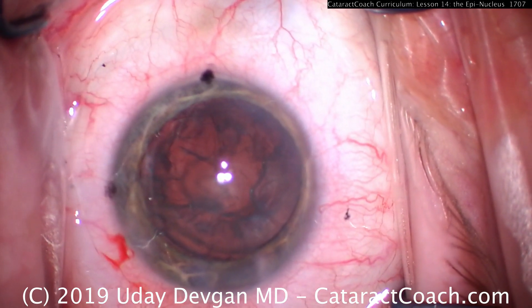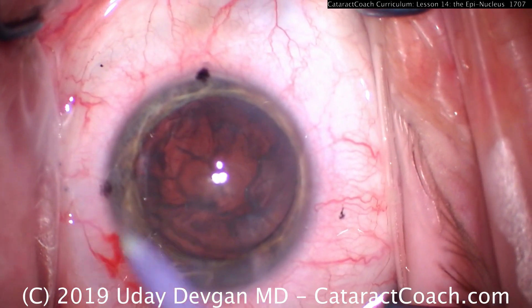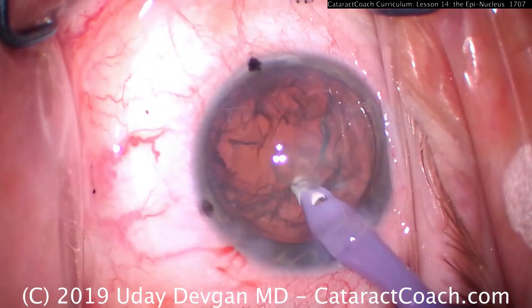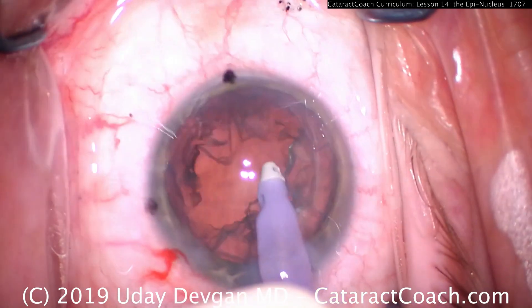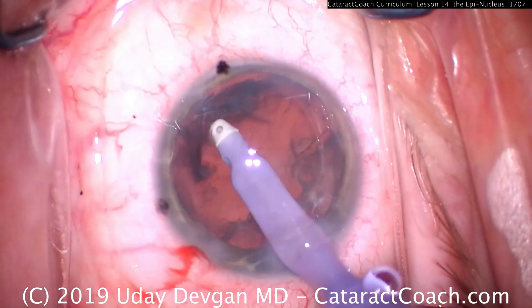You can remove the epinuclear shell with either the FACO probe or the IA probe. The FACO probe is larger bore and will be faster, but it's a little bit more risk if you can't get the epinuclear shell away from the capsular bag. In that situation, it's better to use the IA probe, with its soft polymer or plastic tip — it's very safe.